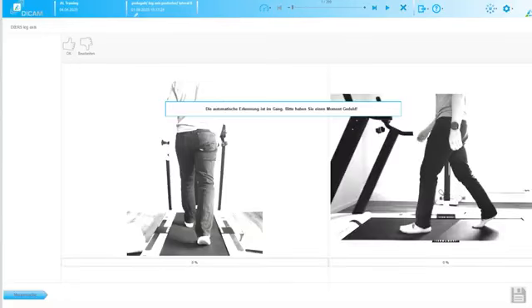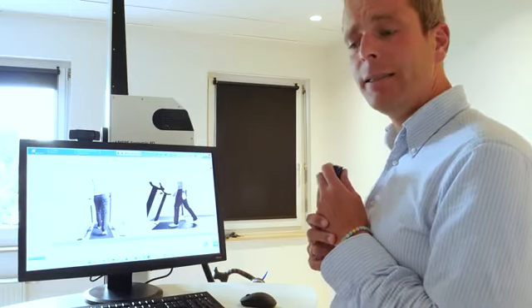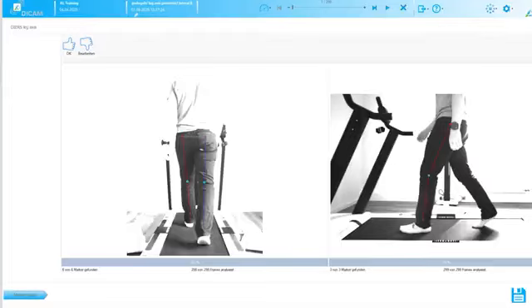The AI is still working on it. The beauty of it, perhaps: it can be retrofitted to all our systems. Whoever is interested in this can contact us. And yes, it basically ran through in one go. We've measured posterior and lateral here to get a full view of knee extension.